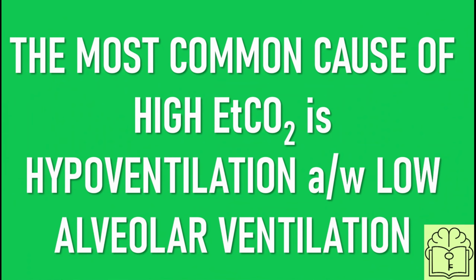The key point here is that the most common cause of a high end tidal CO2 is hypoventilation associated with low alveolar ventilation. This is either due to inadequate minute ventilation on mechanical ventilation. Remember, an increase in the tidal volume is far more effective than an increase in the respiratory rate, or inadequate spontaneous ventilation due to neuromuscular weakness or excessive sedation or anesthesia.